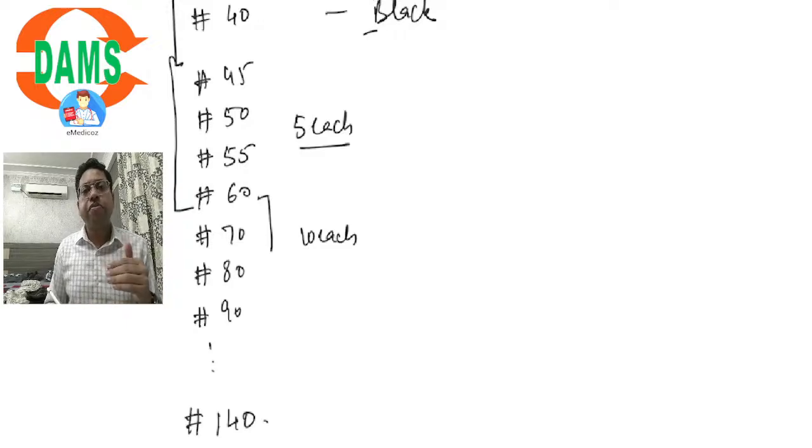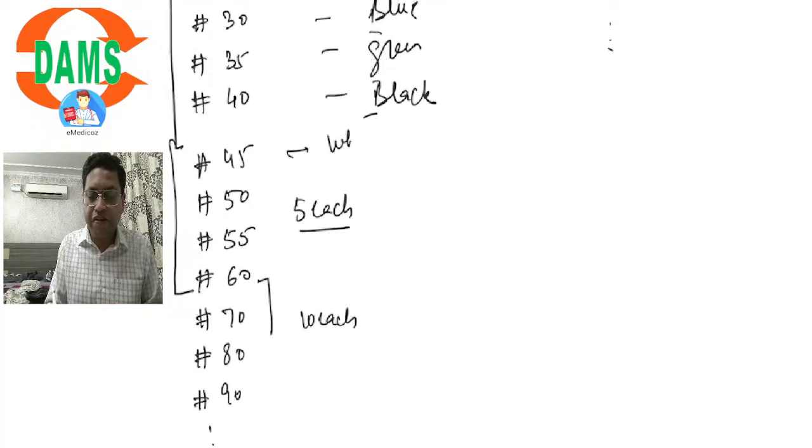And there are 3 special instruments designated with colors pink, gray, and purple. And starting from number 15 till number 140, the instruments would have sizes and colors as white, yellow, red, blue, green, and black. So again, size 45 would be what color? White.